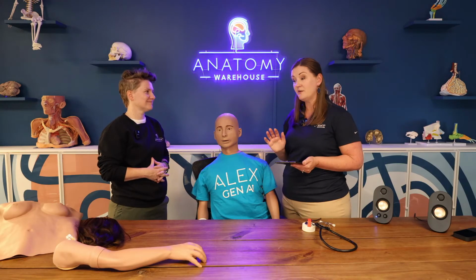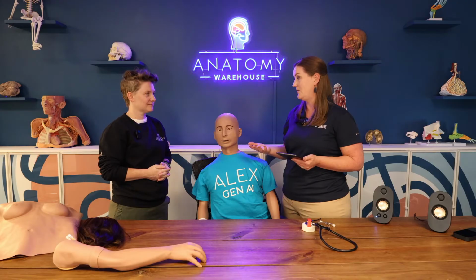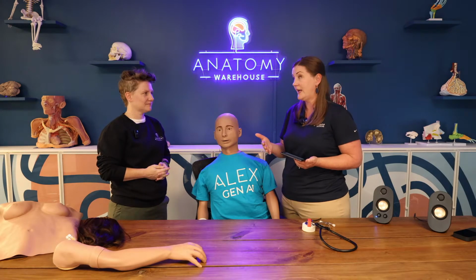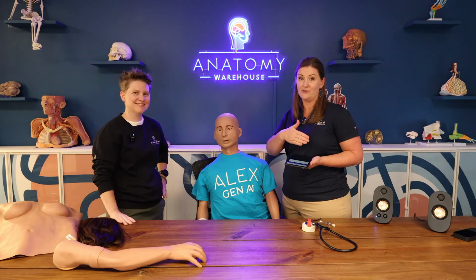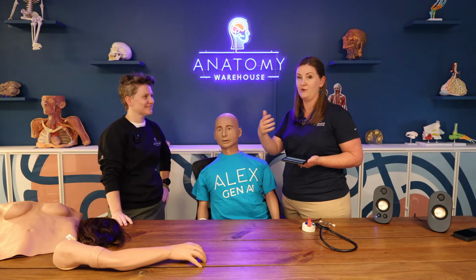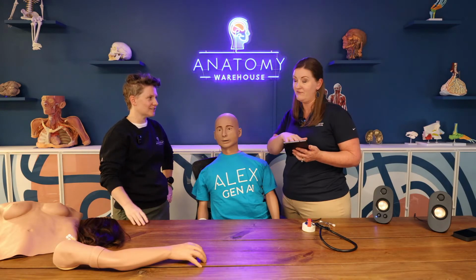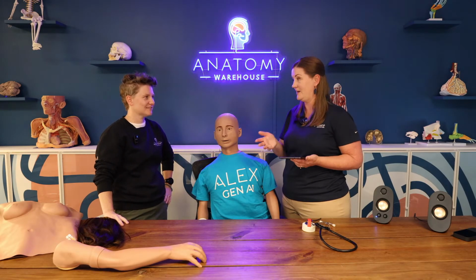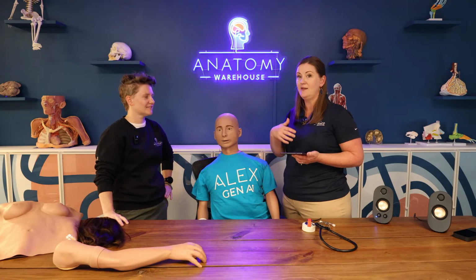Yeah, it's very much a type and tap platform, so if the instructor is following along and maybe they have an overconfident student, and that overconfident student is just kind of plowing through the scenario, they know what the next steps are, they can absolutely trip these students up by influencing the mannequin through the middle of the simulation. They can bottom them out, they could do different things, they can say different things.